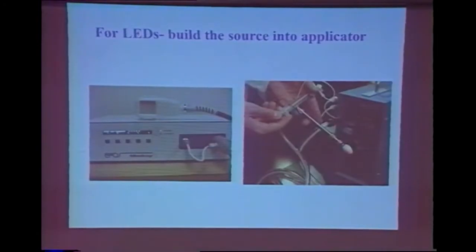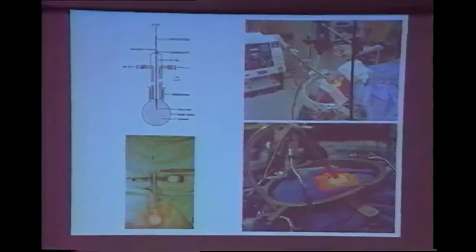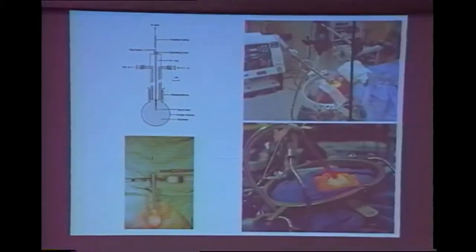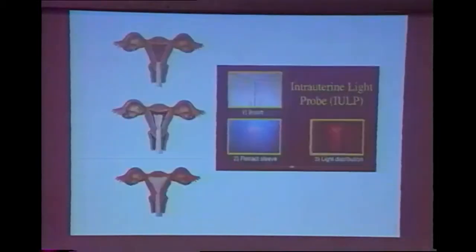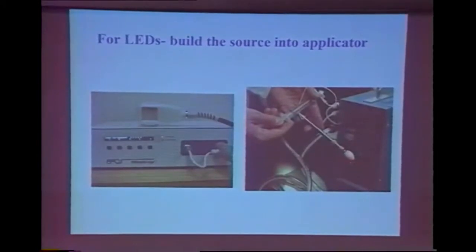With LEDs, rather than having the light source and then the delivery system, you can put the LED right into the tissue. I showed you the example of the interstitial. Here's an example of an LED. In this case, we have the KTP laser delivering light to an optical fiber into the balloon. Another group has taken the same device with the balloon, but now the LED is inside here. And instead of an optical fiber coming down this channel, you have an electrical wire.